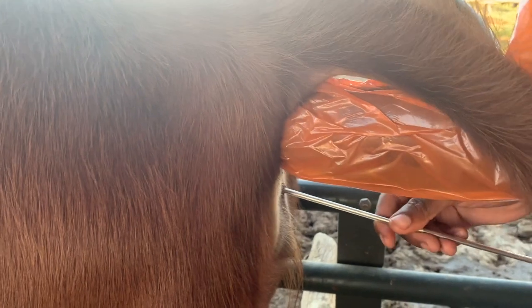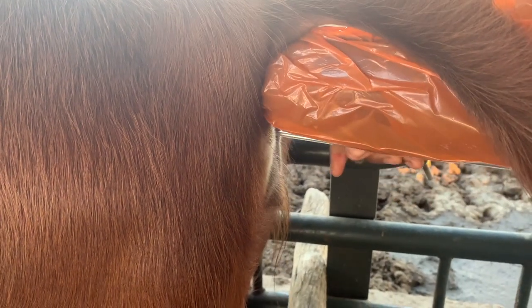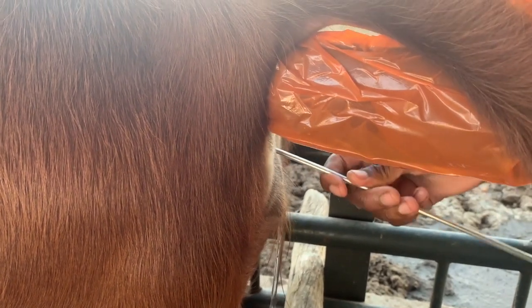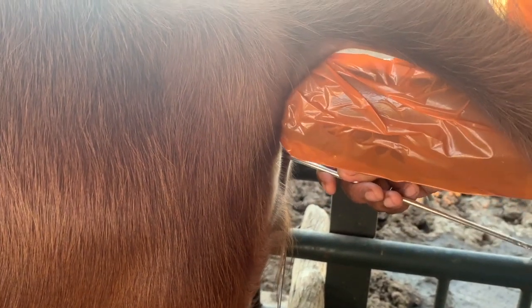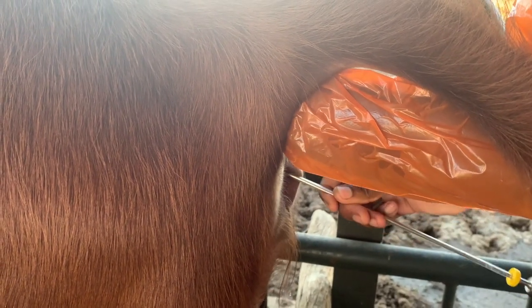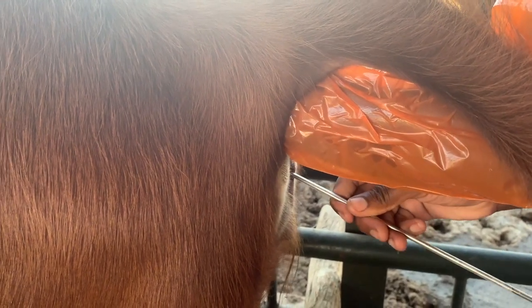Look for the cervix with your gloved hand so that you can bring the mouth of the cervix to the end of your gun. You now need to pass the gun through the three rings of the cervix. Manipulate the cervix to allow the gun to pass through all three rings. Make sure that you remain calm and focused at all times.